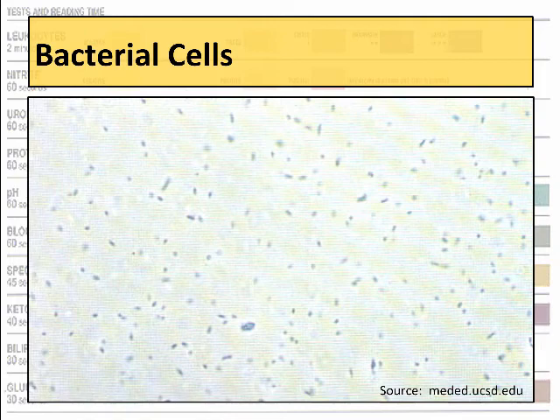However, due to the collection process for urine, it's not uncommon for contamination to happen. And if you were to collect some urine and maybe let it sit out and not refrigerate it or preserve it correctly, bacterial cells can multiply. Maybe you just had a couple because of urethral contamination. You let it sit for a couple hours and there's hundreds of them. You might in fact think that your patient has a UTI when really it was just a contaminated specimen. So that's why that specimen handling and processing is so important, because we don't want to give back faulty results. Well, they're the right results, but not really for the patient.